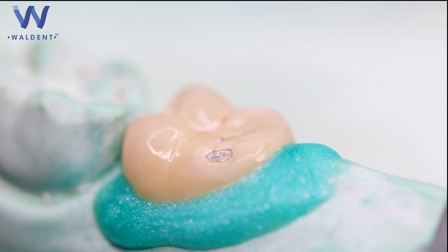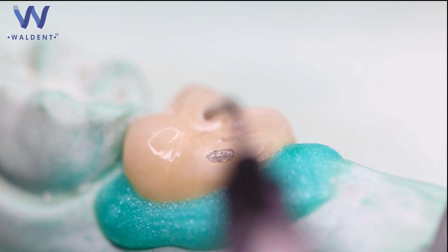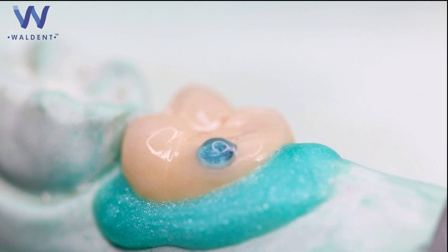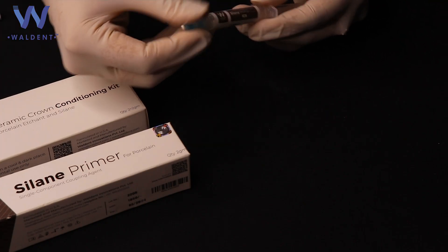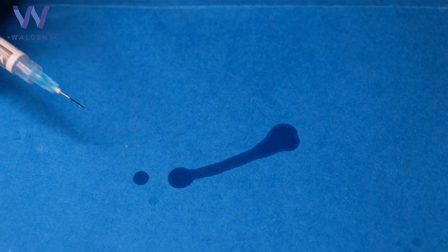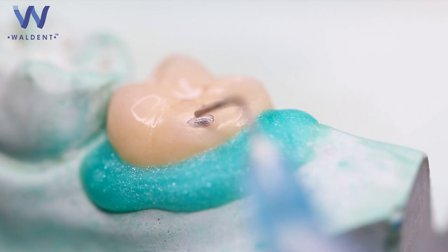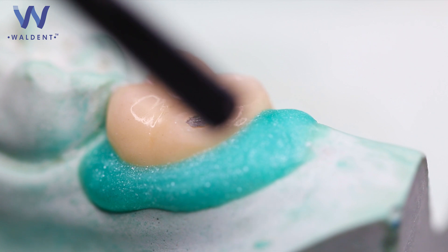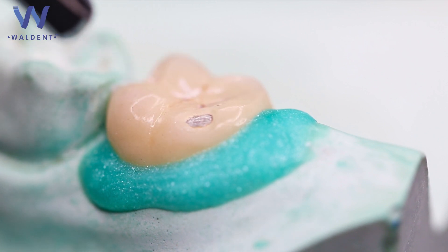Then apply the Walden Phosphoric Acid Etch for 5 to 10 seconds to remove porcelain salts and debris formed by the hydrofluoric etchant. Then rinse and dry. Now attach the applicating tip to the Walden Silane Primer. Verify flow and consistency before applying. Apply a puddle coat of Walden Silane Primer to the etched surface for 60 seconds and let it evaporate. Then blow with a gentle stream of air until completely dry.